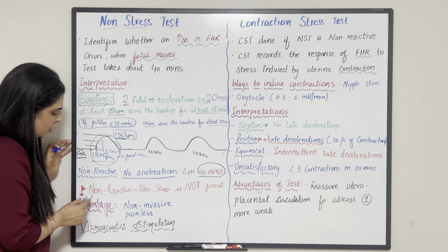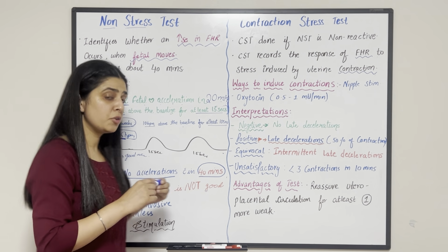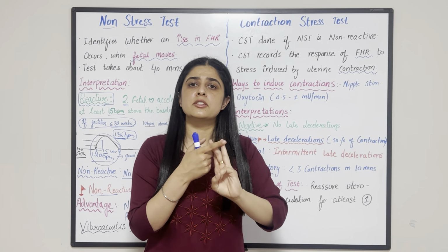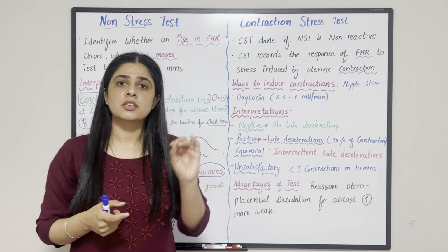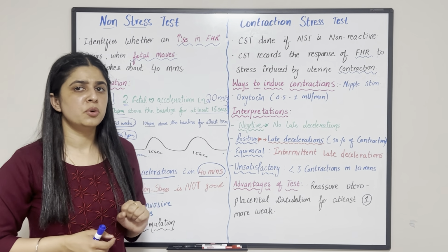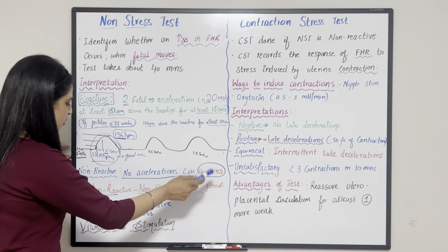If non-reactive, the non-stress test is not good, you need to remember the 3 N's. Non-reactive, non-stress test is not good, that means your fetus is having hypoxia or is going through fetal distress.